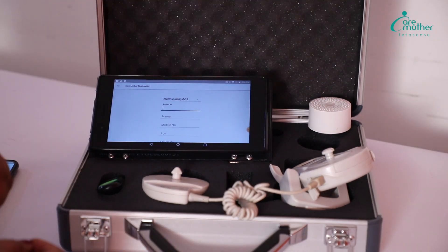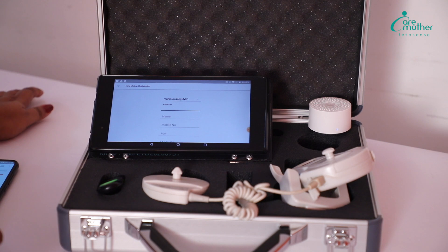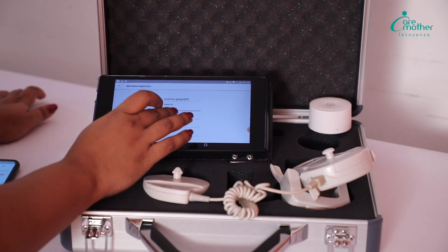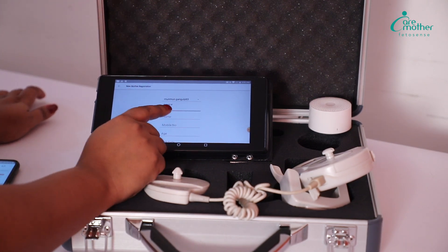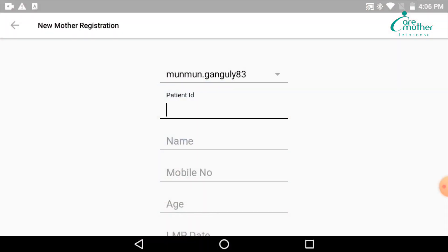After we have switched on all the devices, we will put in the patient data. The first thing is a slot for patient ID. This is an optional field — hospitals who have a unique patient ID can put it here. Otherwise, this field can be left blank.